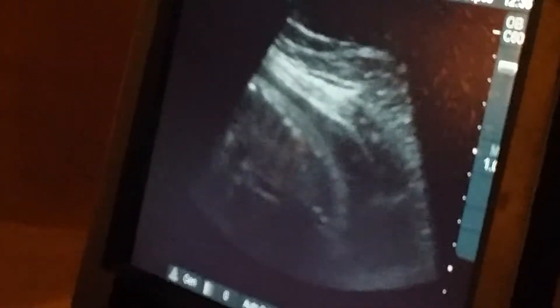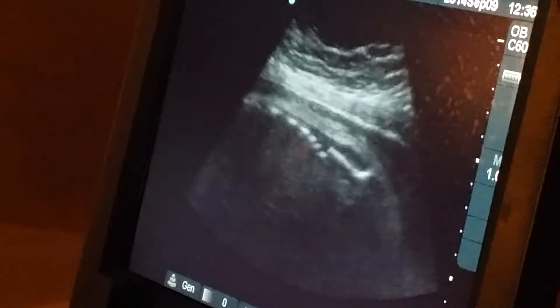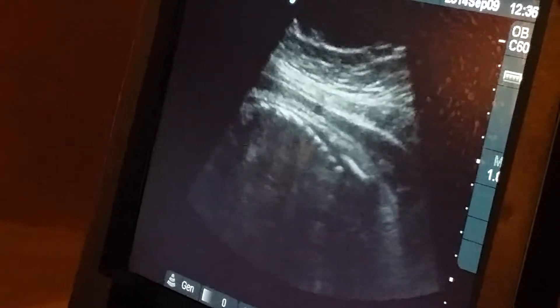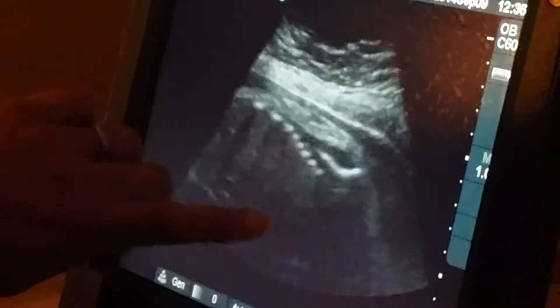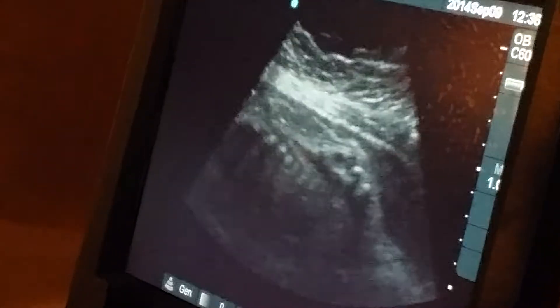You want to see the baby's back? Right there — that's the baby's back with the heart beating away. See right here? That's the heart. That's what we normally listen to.